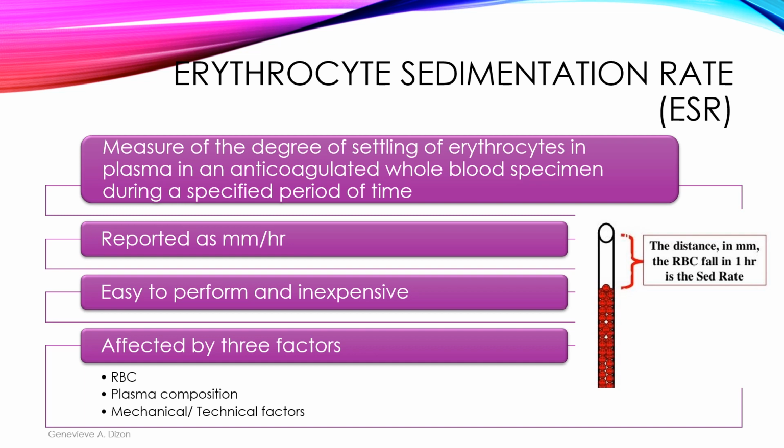It is also affected by 3 factors: red blood cells, plasma composition, and mechanical or technical factors. Given these 3 factors, it means that ESR is also prone to a lot of errors that can falsely increase or decrease sedimentation rate.